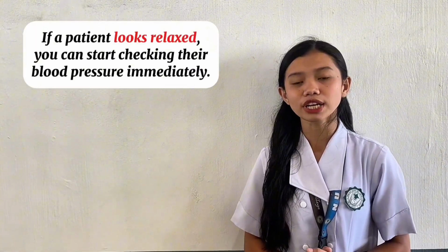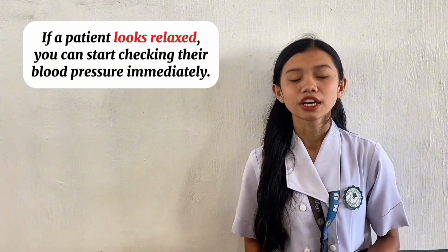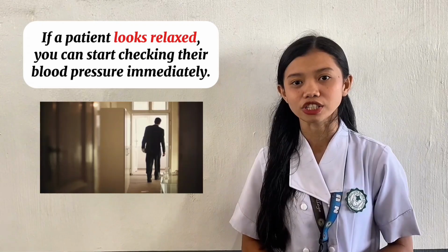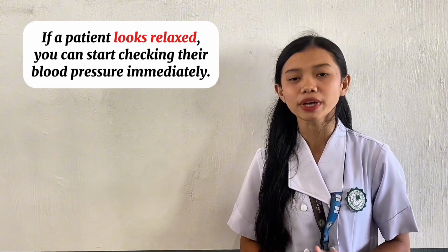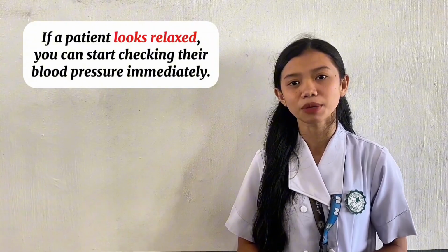So the first one is in the preparation and assessment. Many think that if a patient looks relaxed, you can start checking their blood pressure immediately. But in reality, even just walking to the chair can spike the blood pressure. And taking the blood pressure upon sitting can overestimate the systolic pressure by 10 to 15 millimeters of mercury.